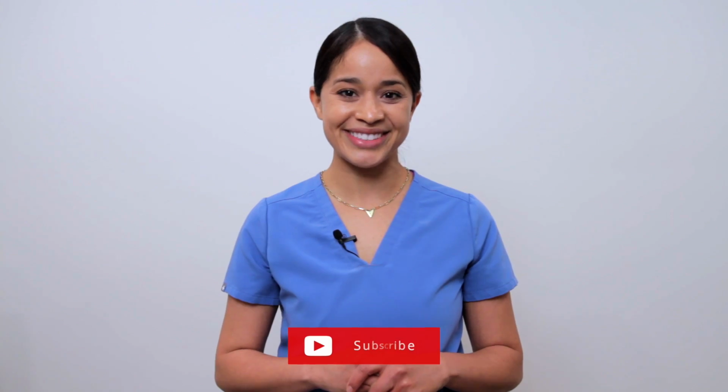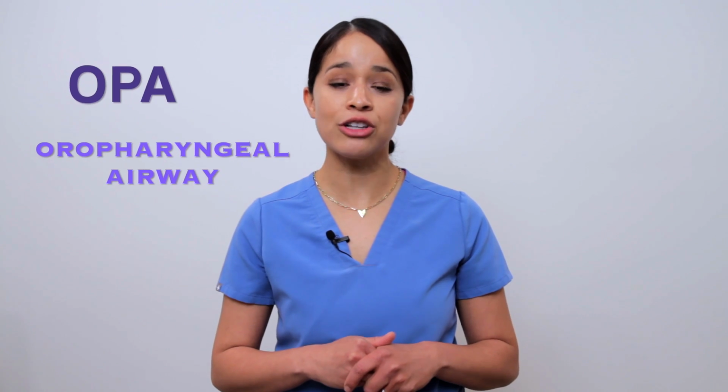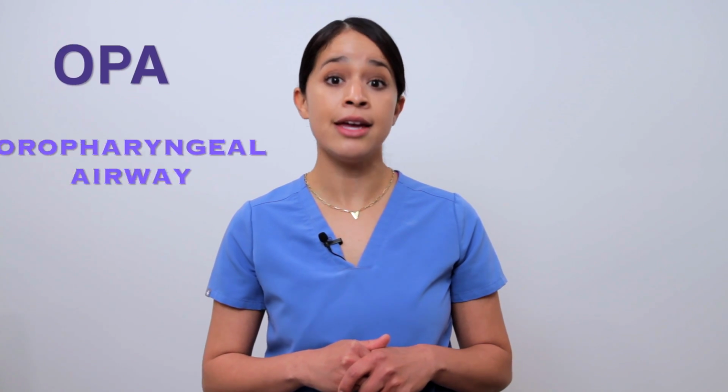Let's get started. Airway management requires emergent intervention to protect your patient's airways. So an OPA, also known as an oropharyngeal airway, is used to help keep the tongue from obstructing the airway for your unconscious patient. An OPA helps keep the airway open, as this is not ideal for the patient that is conscious because it will elicit a gag reflex.